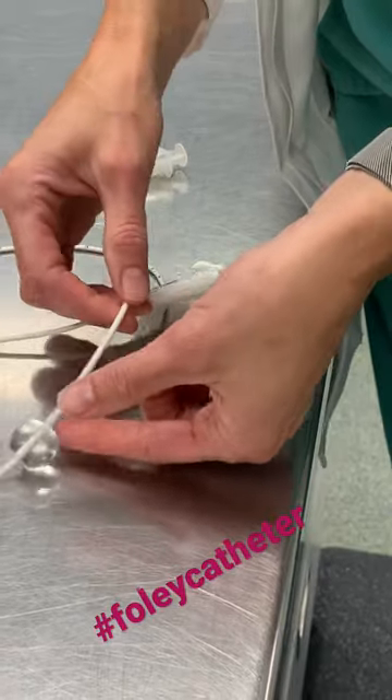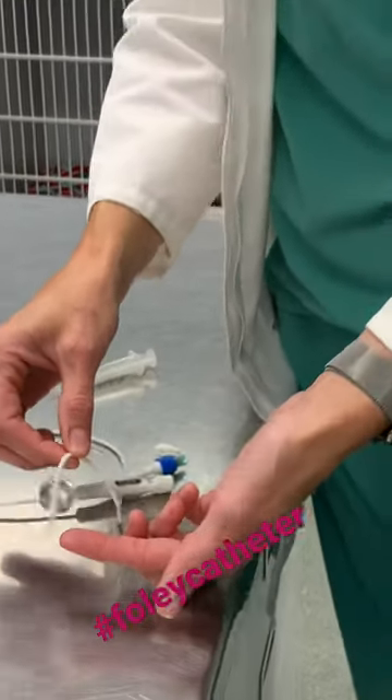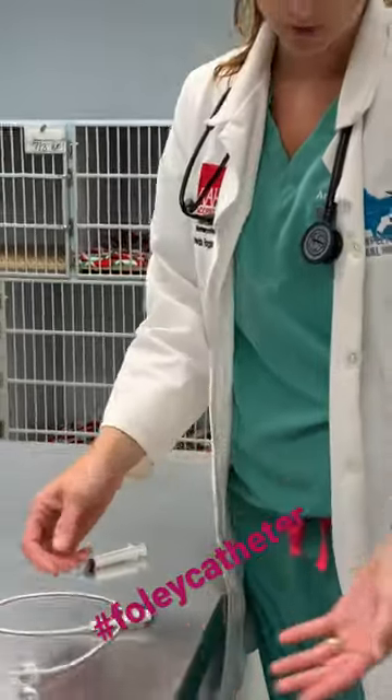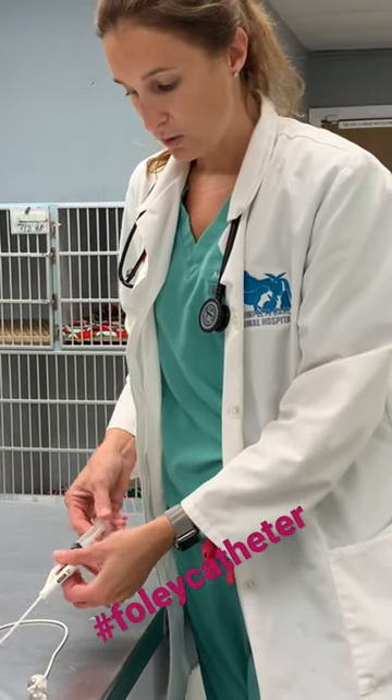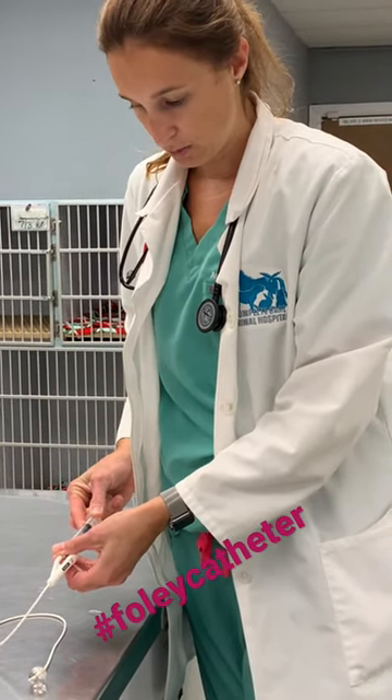Once this is in the bladder, the balloon fills up so you can't actually pull it out of the patient. It's a nice way to secure the catheter. When we have to remove it — as we did today for this patient — we simply drain all the liquid out of the balloon.